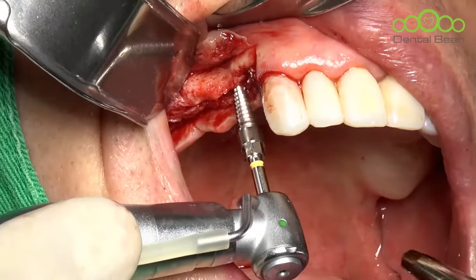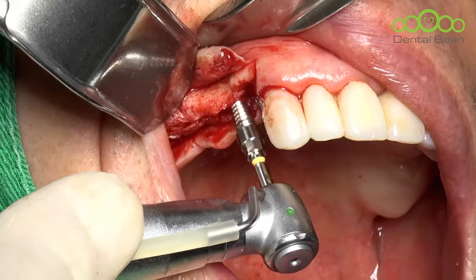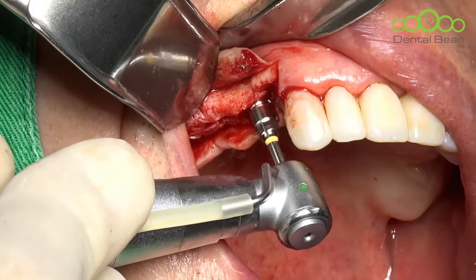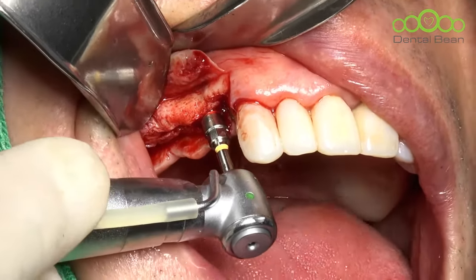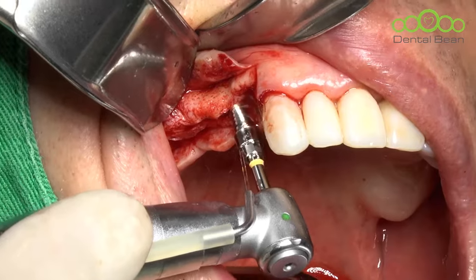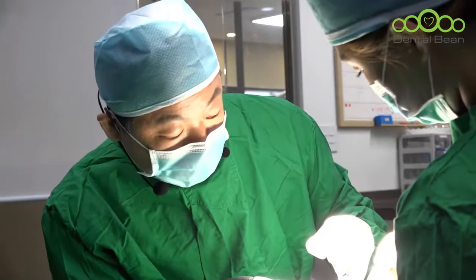Here. Okay. Bone is dense. Okay. Better to use some water because it looks like too dense bone. And forward.